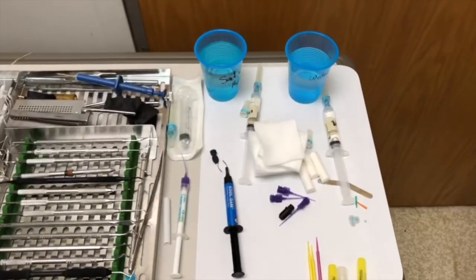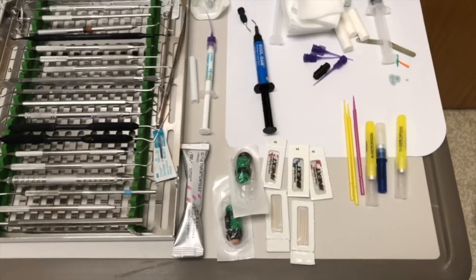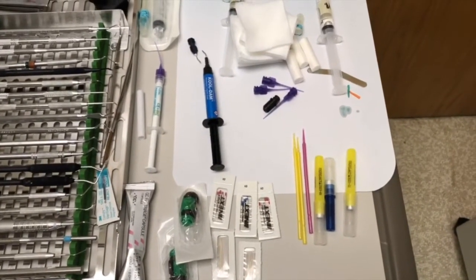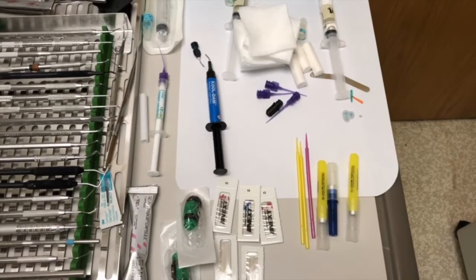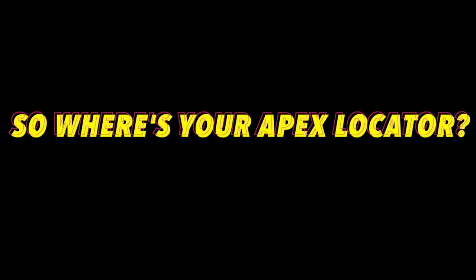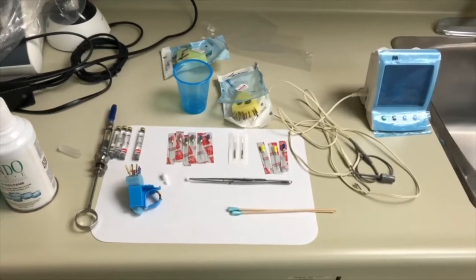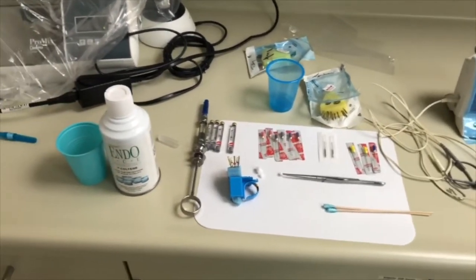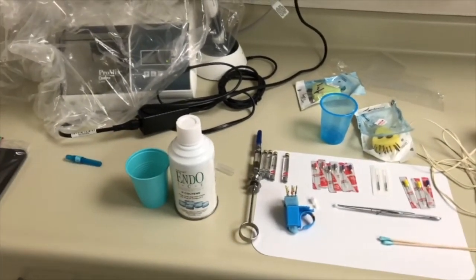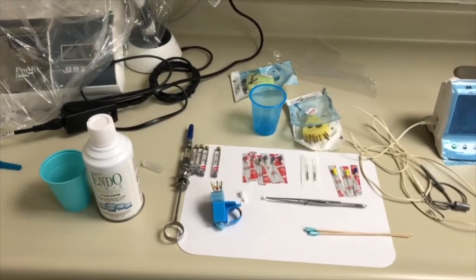We have our solutions labeled: calcium hydroxide, Opal Dam, temporary material, extra paper points, extra needles for anesthetic, and extra micro tips as well. We have our Root ZX and files off to the side with our anesthetic and endo ice. We have extras because in these times we want to make sure that if something drops or you need more files, people are not having to leave the room to get things.